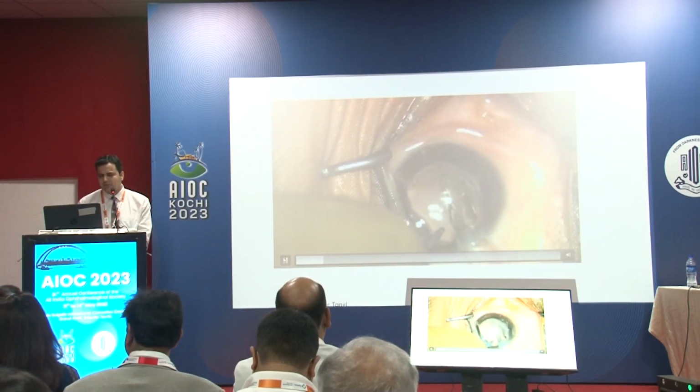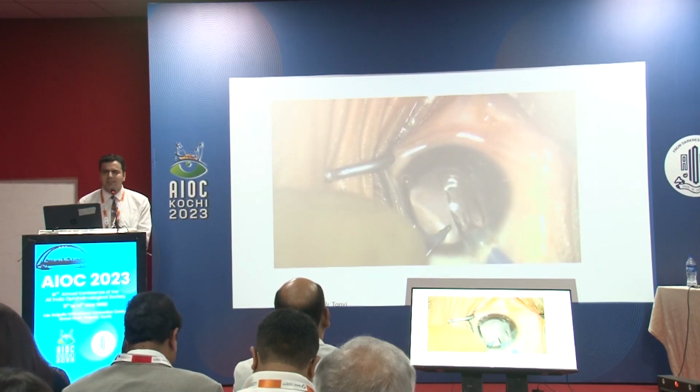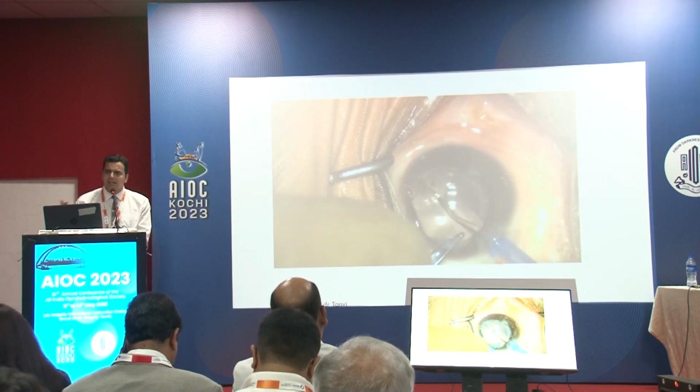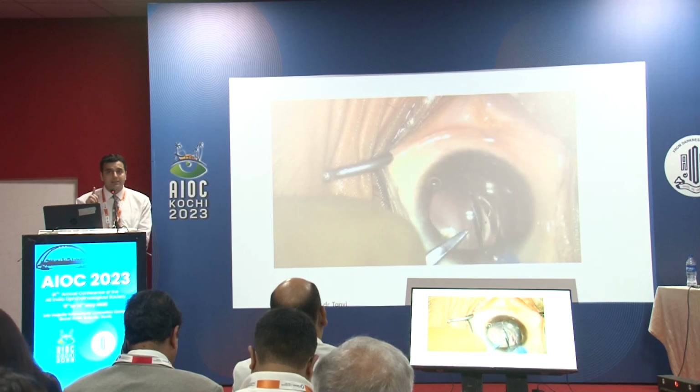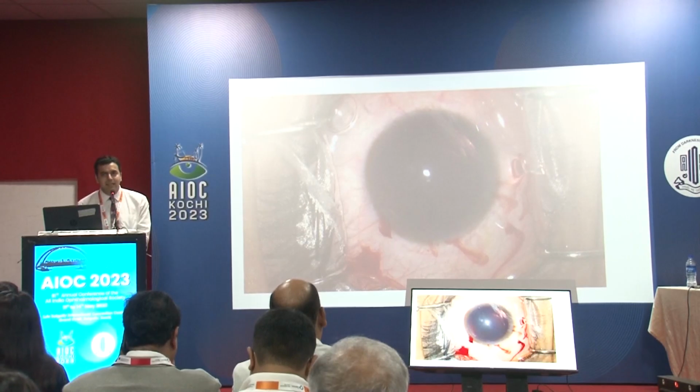Now, what happens in some cases is the inverted insertion of the lens. This was used as a piggyback, and the lens goes in very nicely, but suddenly the haptic gets stuck between the cartridge and the plunger, and that's where you land up with an inverted phakic IOL. Now, for this, what we had changed over the past is to start having a second instrument.